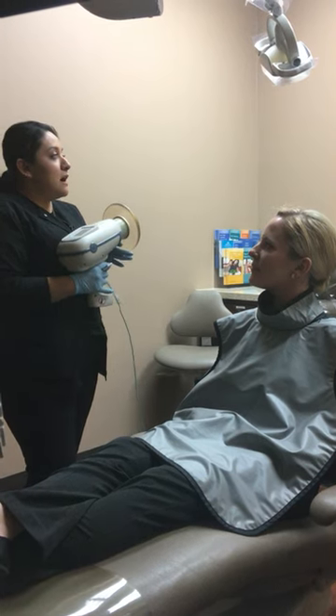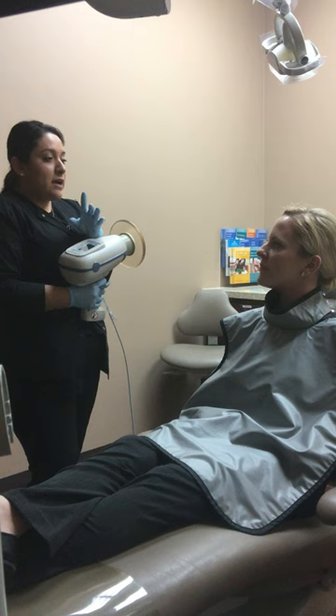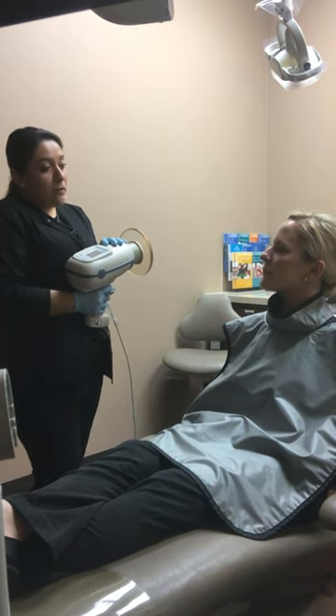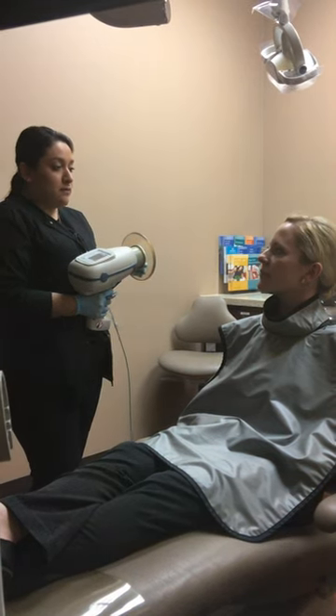We're going to do the x-rays that entail within the regular exam, which is two x-rays in the front and four x-rays in the back. The first two I'm just going to have you open wide, not having to close your teeth together, and then the last two I'll just kind of walk you through it. Okay.